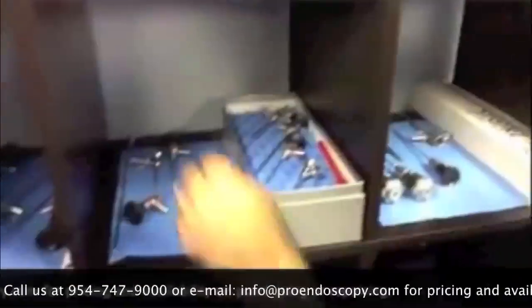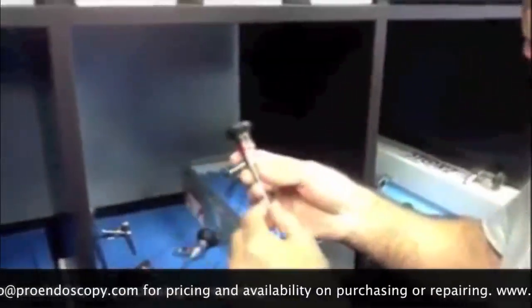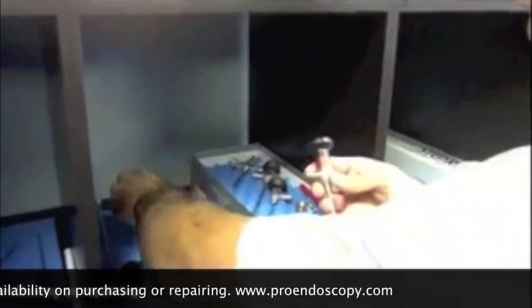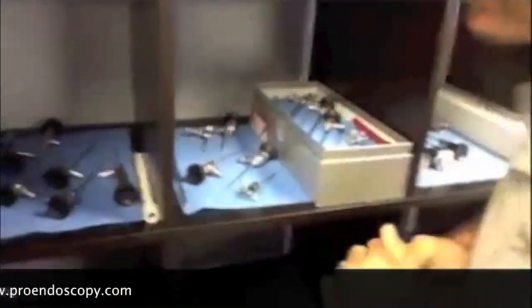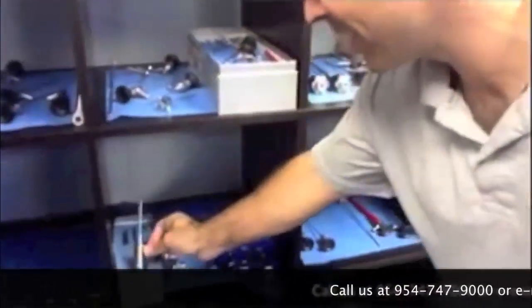This is a 1.9mm. We have different types, different brands. Here's an autoclavable one with its trocar sheath. We have more here, another set there — we have a bunch. We like to handle the specialty items here. Here's a 2.7mm as well.